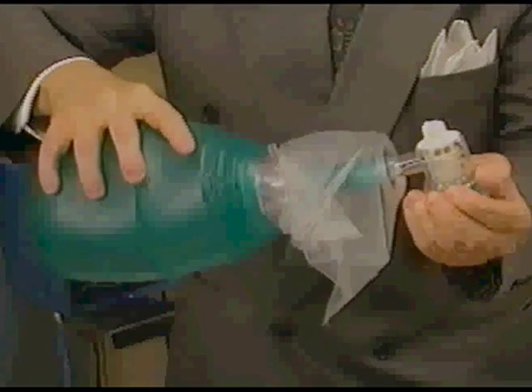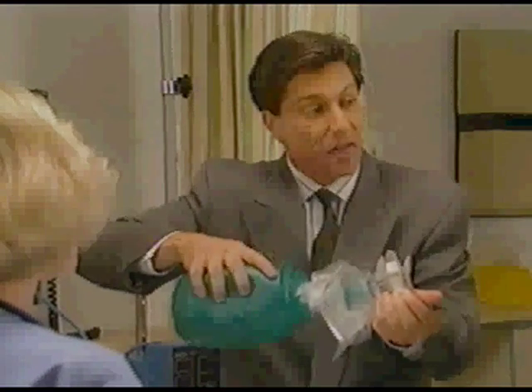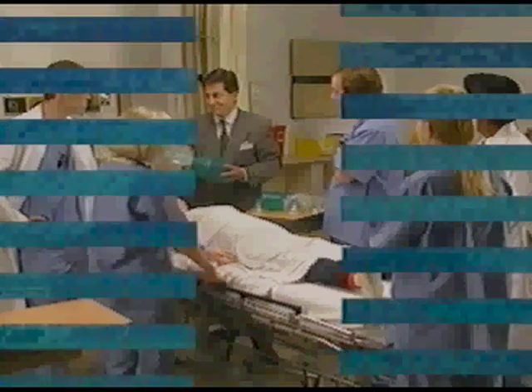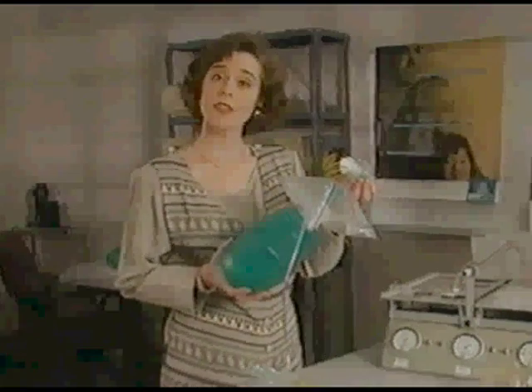You shouldn't see any deflation of the squeeze bag nor any inflation of the oxygen reservoir. If you do, get another bag. Do not use a bag that doesn't pass this test. Now let's take a look at the bag itself. When you unpack and test BagEasy, you notice its innovative design.